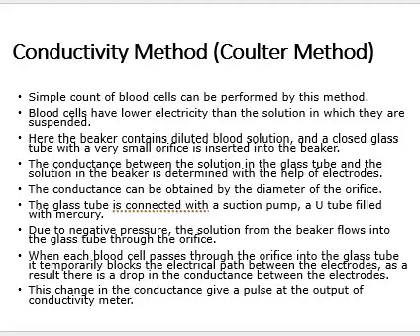Next, we are going to discuss the conductivity method, or Coulter method. What does conductivity mean? Electrical students will know what is meant by conduction, what is meant by open circuit and what is meant by short circuit.